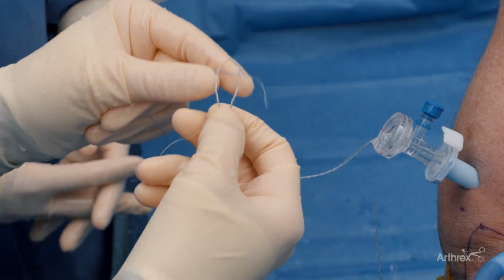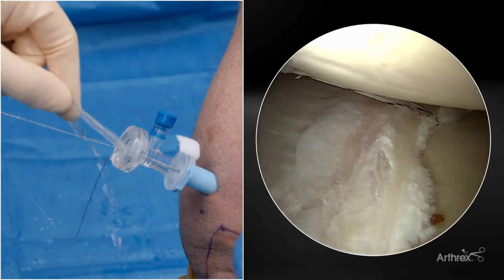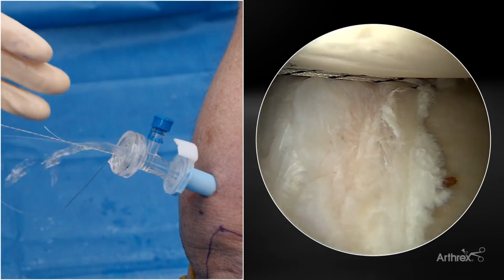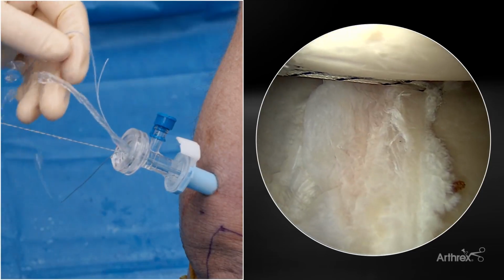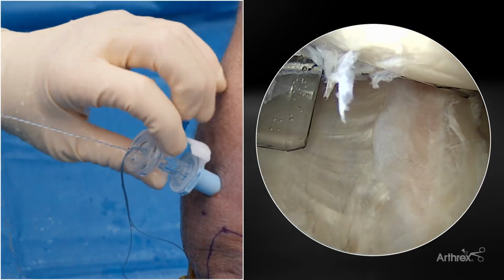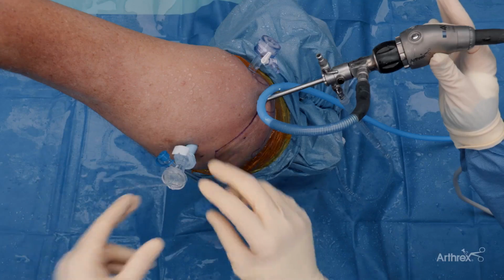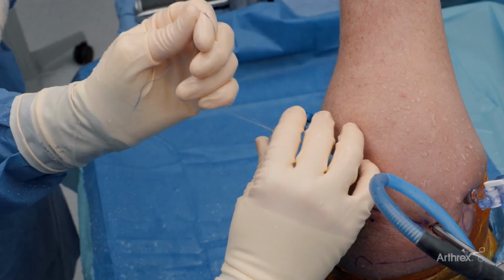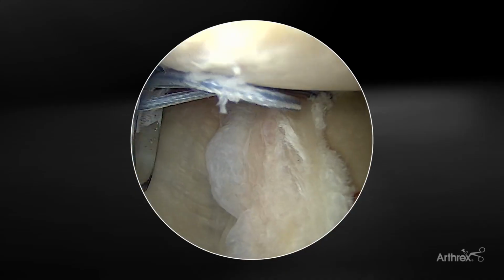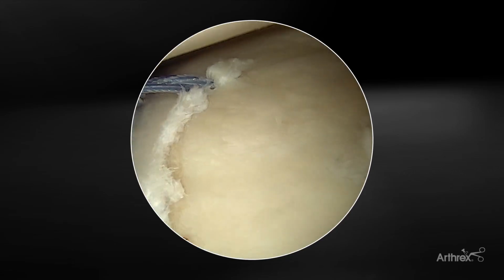So we have our loop, and now this is where we use the mark on our working stitch. Holding tension on that, now I'm going to pull my other suture in, and I'm continuing to hold tension here all the way until it gets to the cannula, and then I can release that. We want to make sure that this loop of suture is not looped around the outflow. We have people looking at that as we're doing that, and then I'm just pulling this gently until I get to the suture, and that pulls it through. And now I can just tension this. I'm not going to tension this all the way because I'm going to wait until the end to do this, but I'm just going to get some of this tension down here until this loop is smaller. And when the loop is like this, then I'm going to just leave that here and take this out.